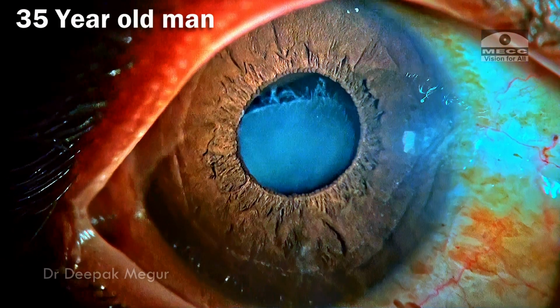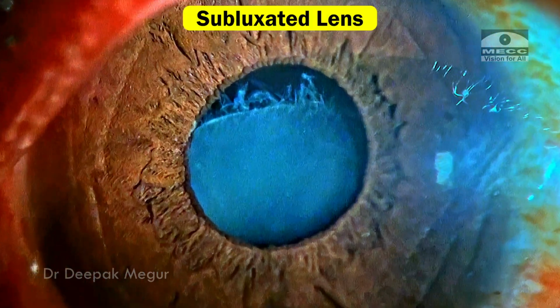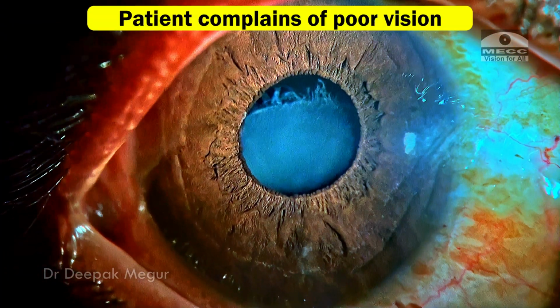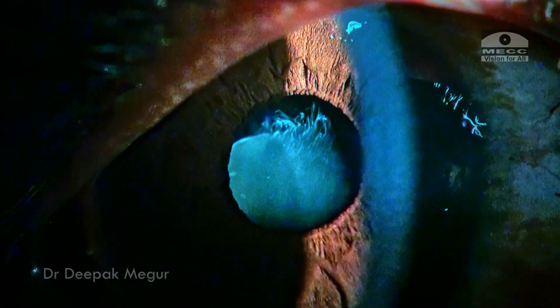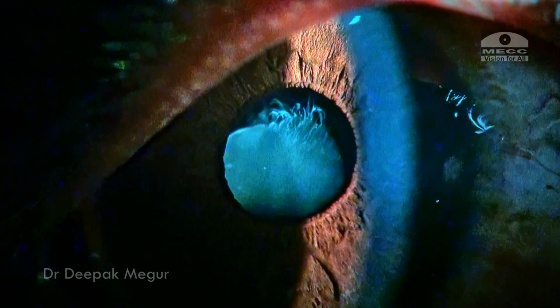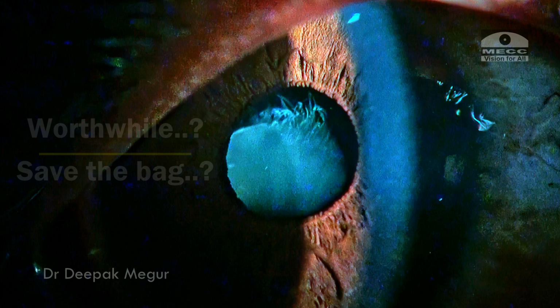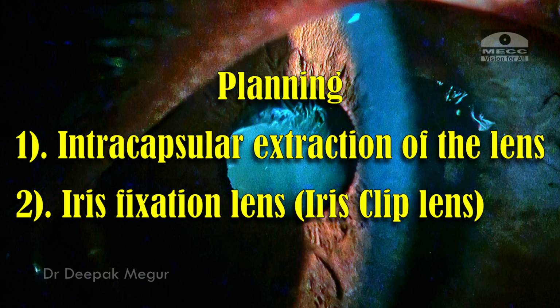Hi friends, this is a 35-year-old gentleman who has bilateral subluxated lenses, Microspherophakia, and he is presenting with poor vision and we're posting him for surgery. The extent of zonular weakness is such that it's almost impossible to save the bag. So my plan is to perform an intracapsular extraction of the lens and then most likely put in an iris clip lens.